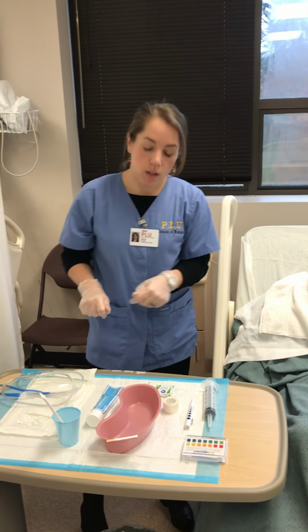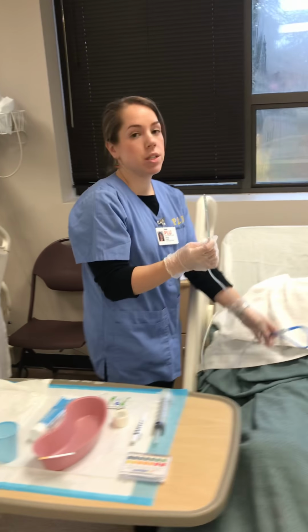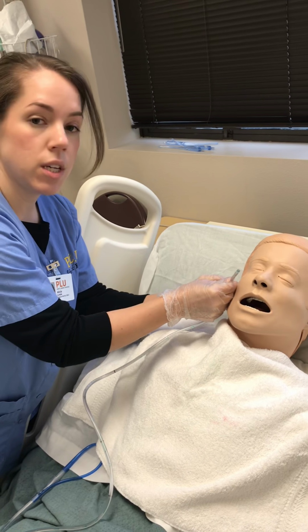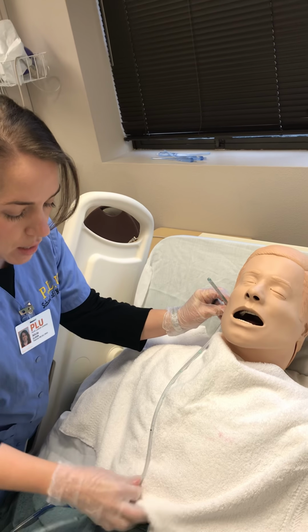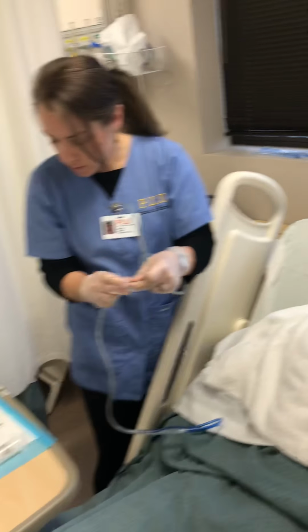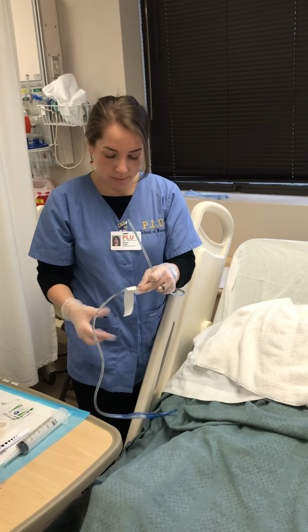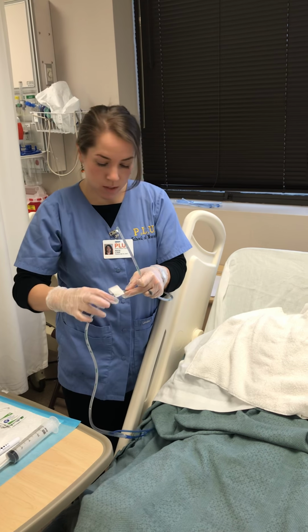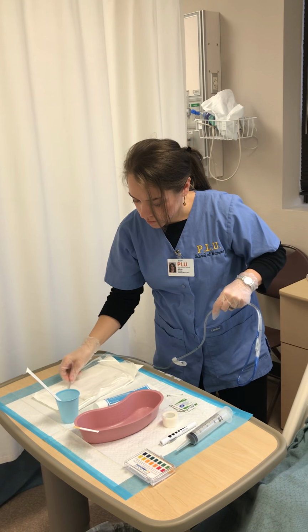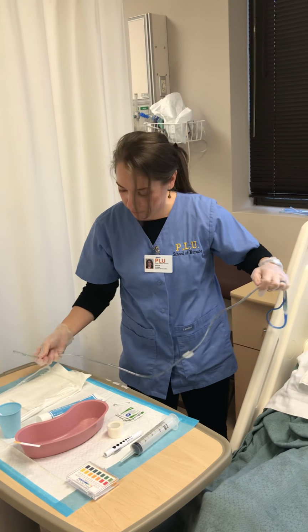And then I will open up the tube, get it all ready, and then I'm going to measure. So I'm going to start by going from the tip of the nose to the earlobe, and then from the earlobe down to the bottom of the xiphoid process. And I'm going to mark that spot with a piece of tape. And once I have that marked, I'm going to lube the tube. I've set up all my equipment ahead of time, so I'm ready to go.